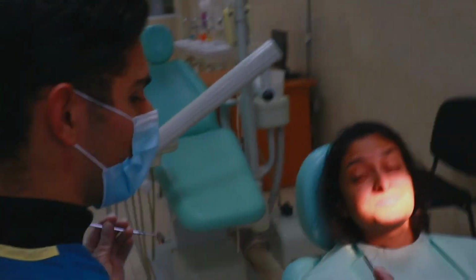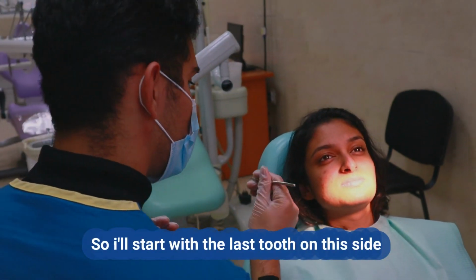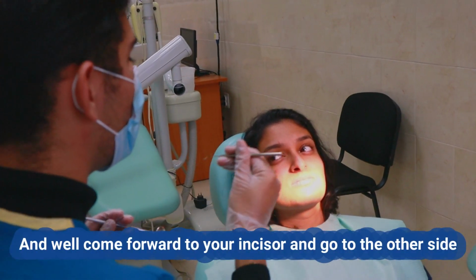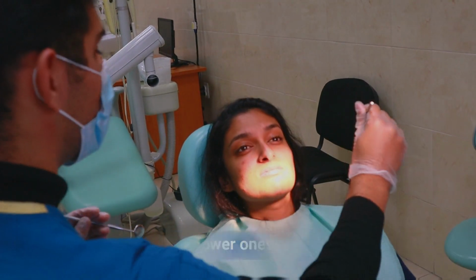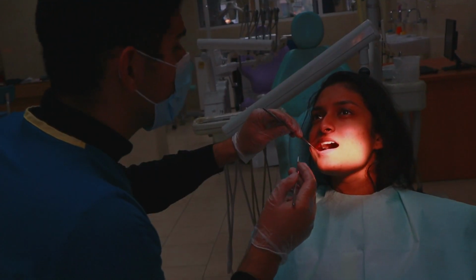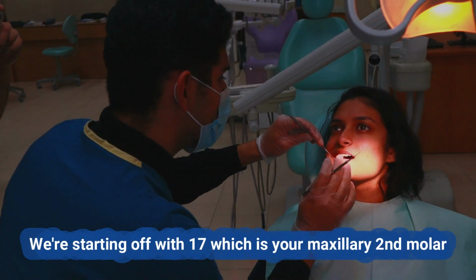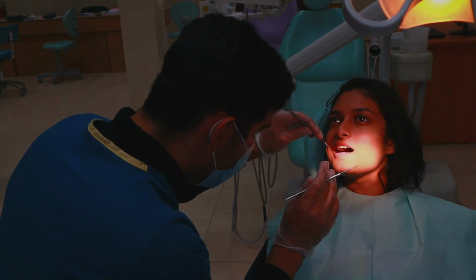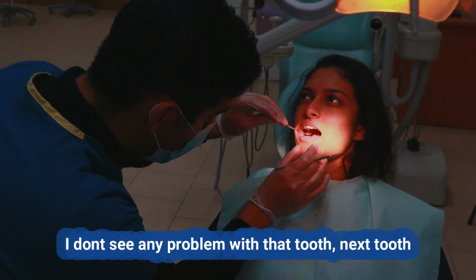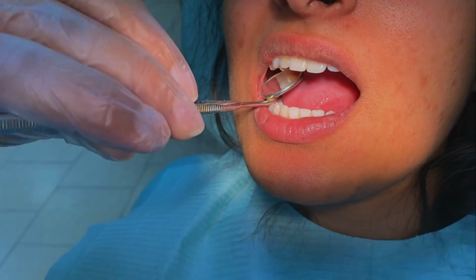Now I examine the teeth in a specific order. I'll start off with the last tooth on this side, and we'll come forward to your incisors and go to the other side, then we'll do your lower ones, just the same way. So we're starting off with 1-7, which is your maxillary second molar. I don't see any problem with that tooth. Next tooth. Now we're looking at 1-6, I don't see any problem there. So you can see 1-5 right here.